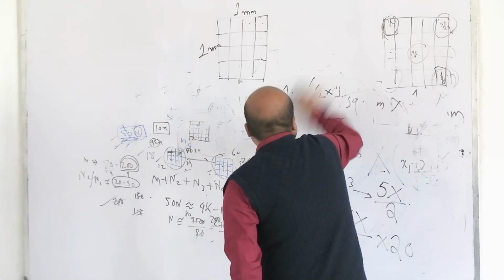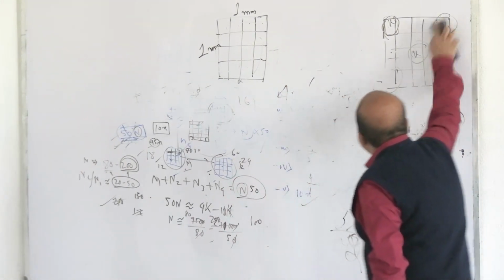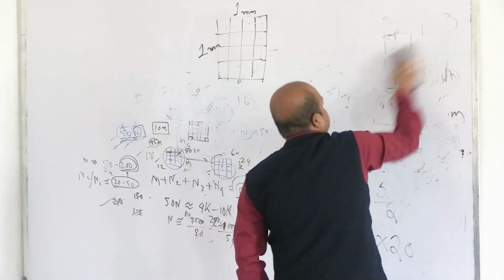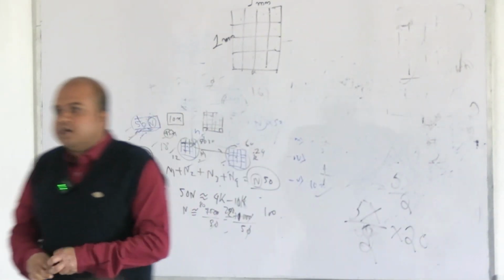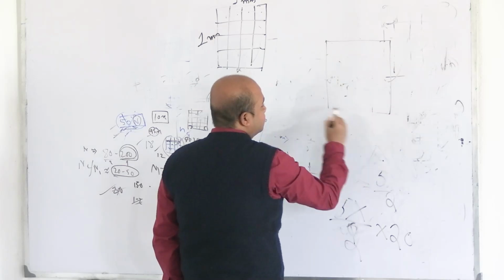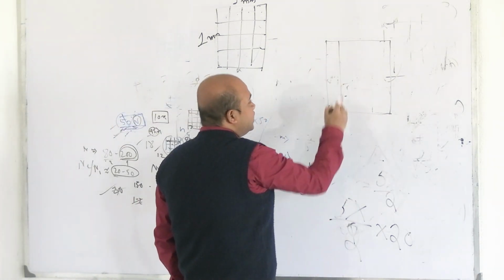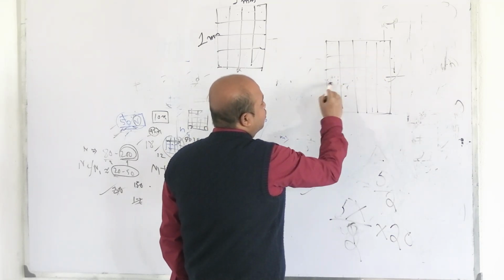That is what most of you have done, I hope. But in case of RBC, what is the difference? In RBC squares, by those triple lines in the non-counting squares, RBC squares are divided a step further. That is, the large square is again, what is the dimension? 1 mm into 1 mm, and that is divided into how many? 5 into 5, 25, not 4 into 4.